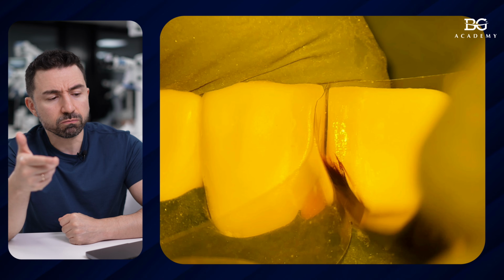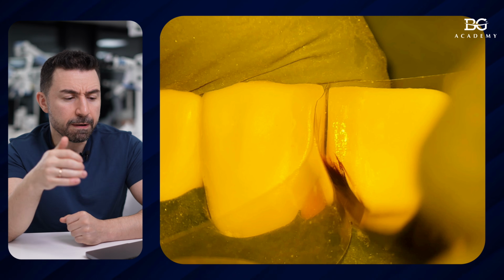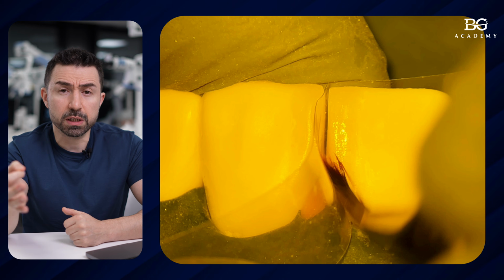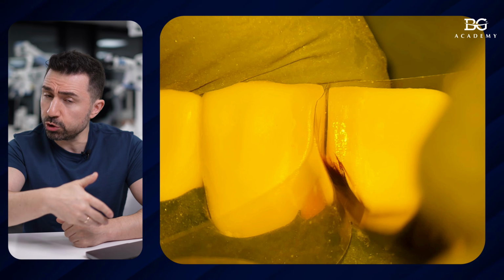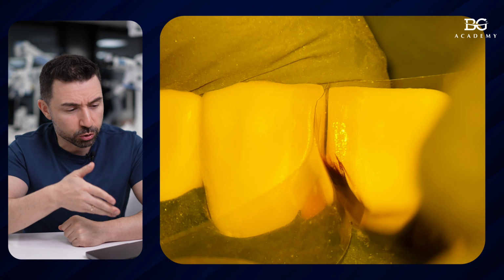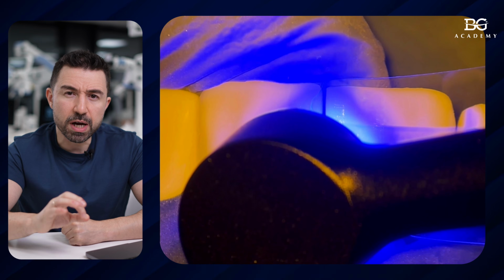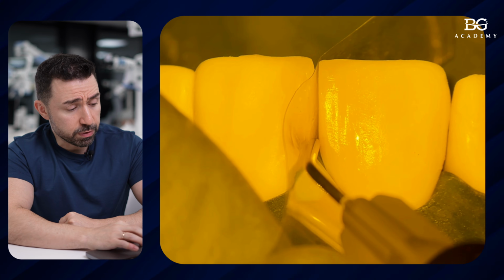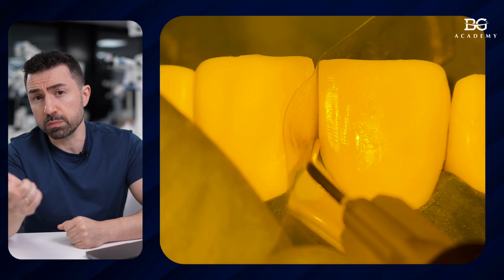Another thing is we put it then on the tooth, okay? We provide re-wetting of the surface using wetting resin. Then you place the transparent strip, then you use adhesive, better to use unfilled or modeling resin, so you will re-wet the surface, buccal, proximal, palatal. For that we use a brush, because it goes into this tiny area. Then we dry everything completely, super dry, then we polymerize from buccal and palatal surface, and then next step we will definitely use a wedge just to create tighter contact. Wooden wedge in such cases works better.